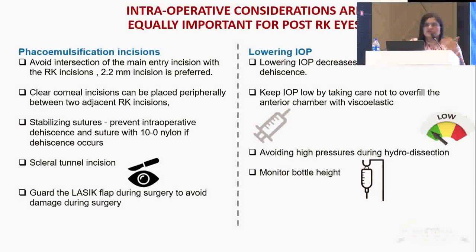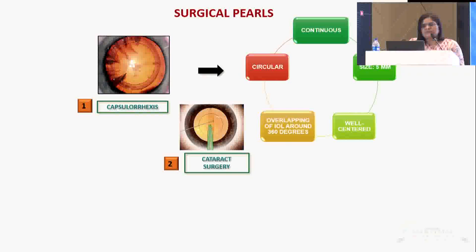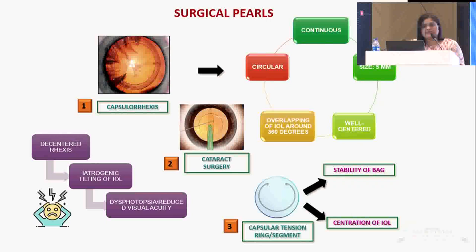Avoid high pressures during hydrodissection, and we have to monitor bottle height. In the phacoemulsification part, when it comes to post-LASIK eyes, guarding the LASIK flap is one of the most important things that we should do. Sudden deepening of the anterior chamber may cause discomfort to the patient. Intracameral lignocaine is helpful, along with lifting of the iris with a cannula in these cases. Of course, a central CCC is very important in good cataract surgery. You can implant a capsular tension ring so that you have stability of the bag, and centration of the IOL is very important, because if there is a decentered rhexis, there can be tilting of the IOL leading to dysphotopsia and reduced visual acuity.